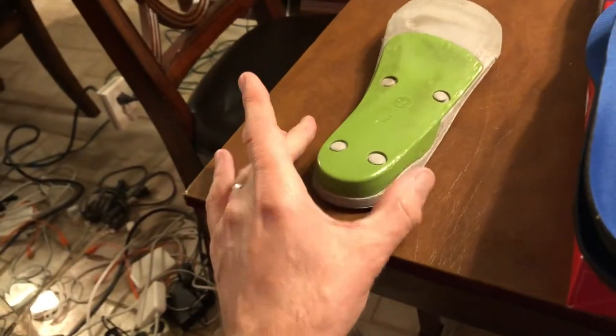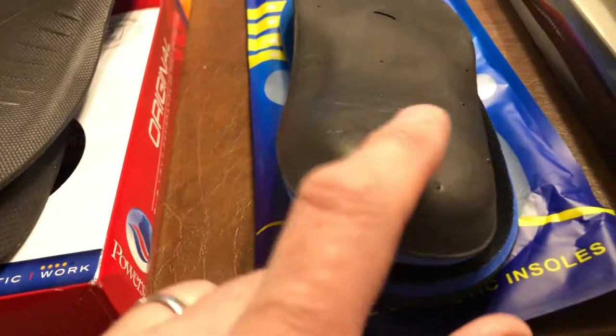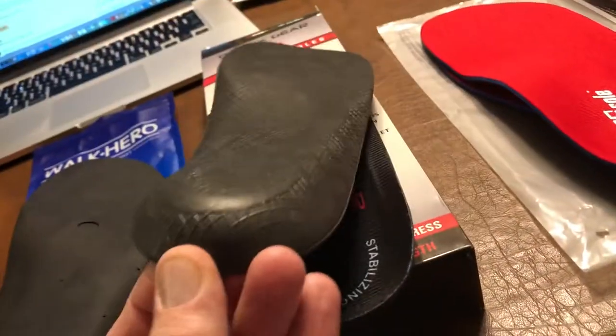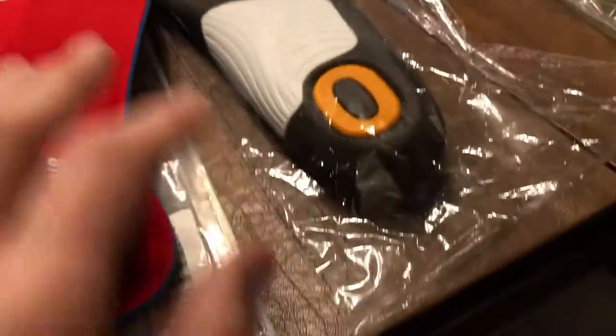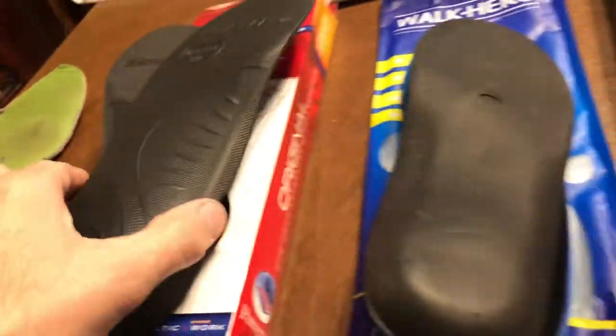One thing Superfeet have that none of the others do is a square bottom, which I assume prevents the insert from rocking side to side in the shoe. The Power Steps come close, Walk Heroes are sort of flat, some others are very arched and could probably roll around. But this green one actually has a nice square bottom, which makes it seem more worthy.